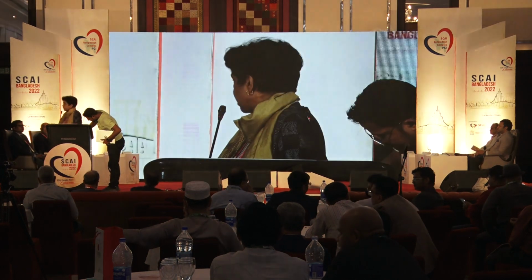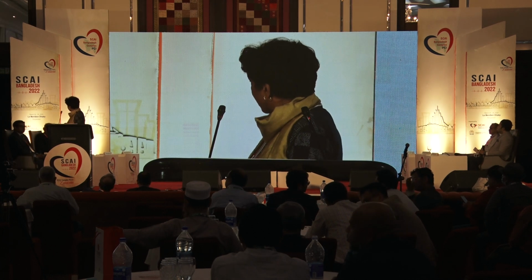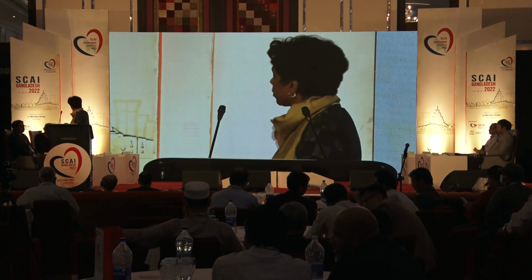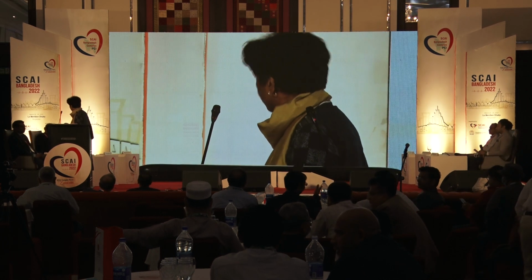That would be a good thing to have, some kind of support, and usually we keep our IABP on standby. Another thing that I found very helpful is that if the patient has a good ejection fraction, life is a lot easier. Try to avoid doing rotablation, at least in the first 100 cases, in a patient with poor ejection fraction, especially if you don't have any ventricular support system. Even if the ejection fraction is good, we keep adrenaline diluted, and if we see a bit of hypotension, we just push that. And in the rota solution, another thing we do is add nitrates as well.